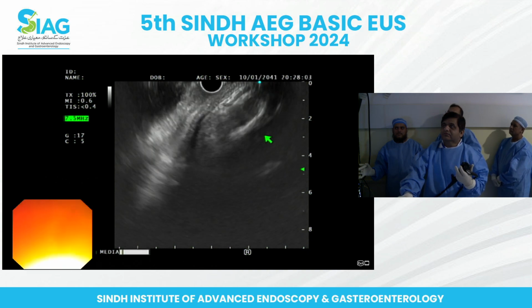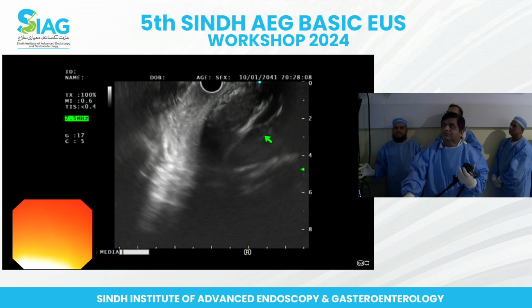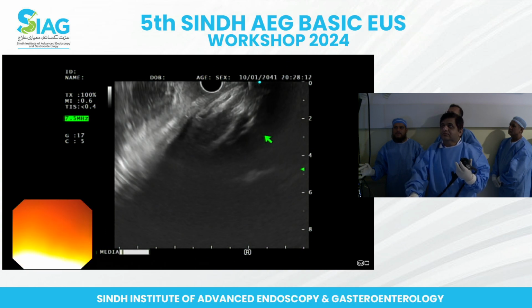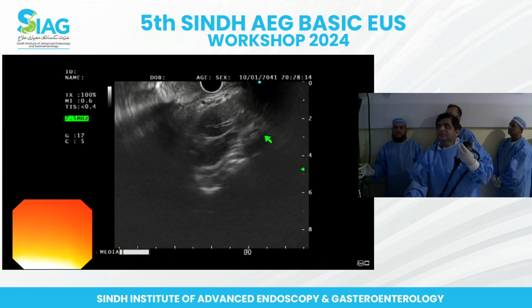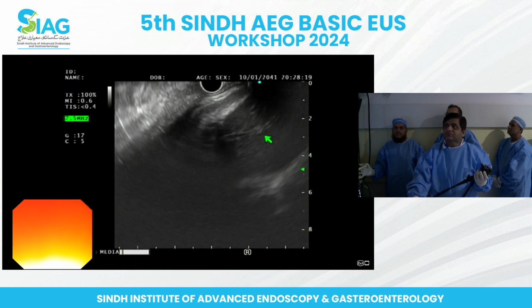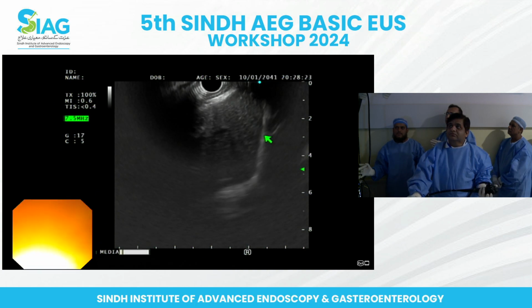Okay, so clockwise rotation. Okay, once you're lost, go back to the previous position. Don't waste your time looking into the structures which are not making sense. So if you're lost, go back to the first position, learn to maneuver to the previous station in a quick fashion.